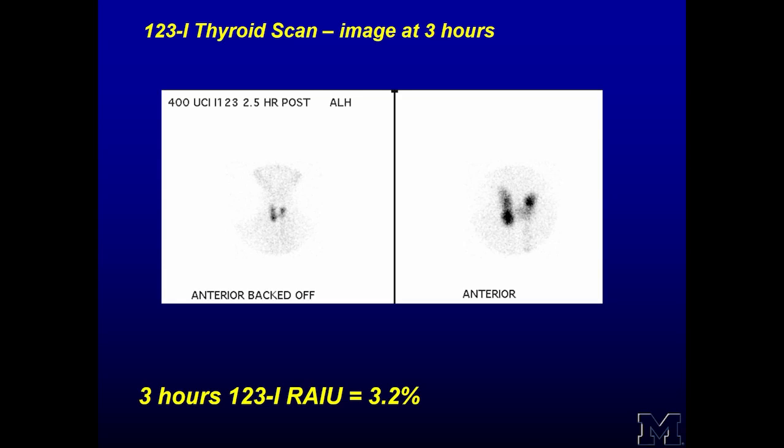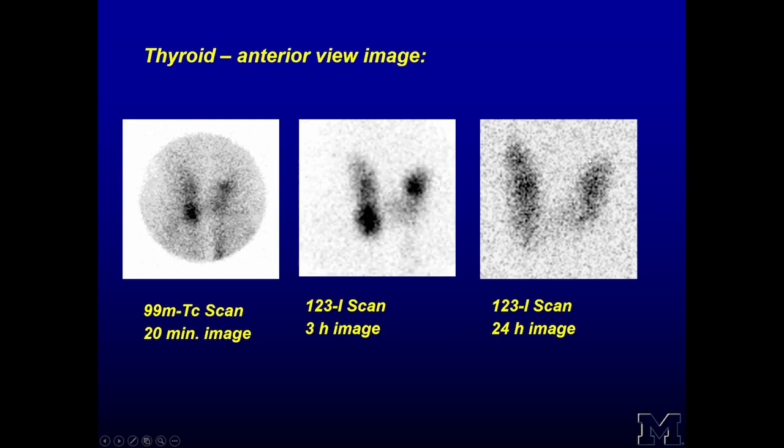This is the early image presented, and as you see, the image is very, very similar to the technetium pertechnetate image presented previously. Again, we see this inferior right thyroid lobe hot nodule appears hyperfunctional. However, on the delayed image that is presented in this panel, we see that the radioisotope washes out on delayed imaging.